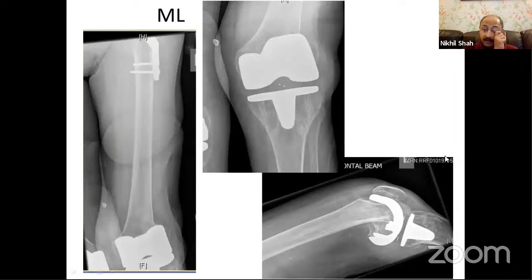Another example of an uncemented LCS knee replacement in an elderly patient who has a DHS at the top for a hip fracture, and she fractures. Now her femur is extremely soft and extremely porotic. And you can imagine when you try and take out that LCS uncemented tibial component, it is going to cause a lot of damage to the tibia.